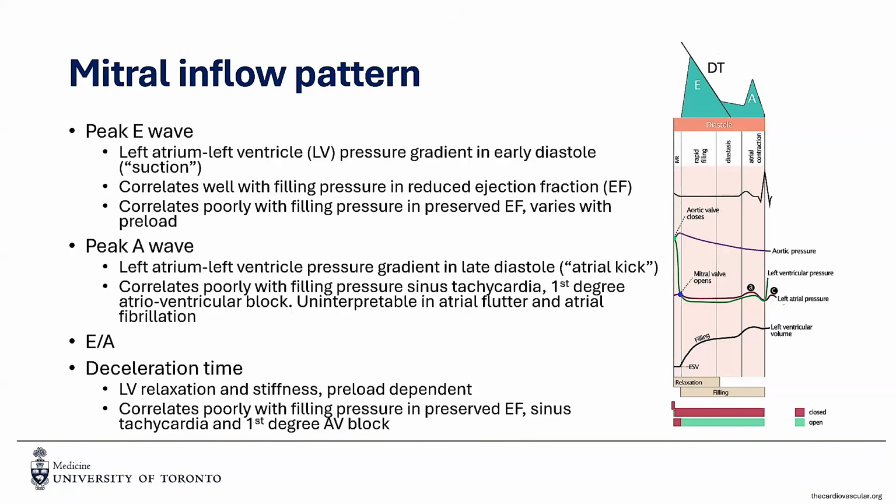In general, the E wave is thought to correlate relatively well with filling pressures in people with reduced ejection fraction. However, in preserved ejection fraction, the E wave correlates relatively poorly because it can be influenced by left atrial pressure and also the rate of ventricular relaxation. This dependence on preload oftentimes limits its utility in isolation, and I'll talk about this in one of the next slides.